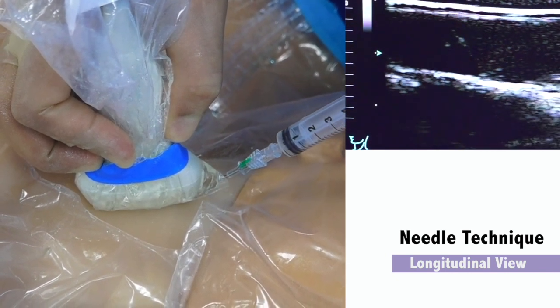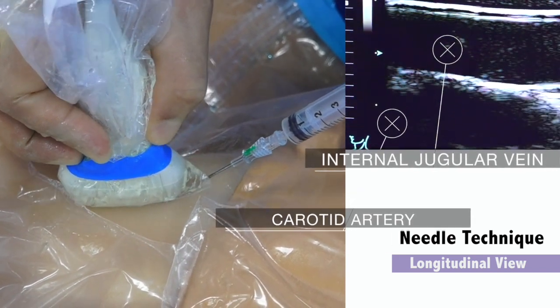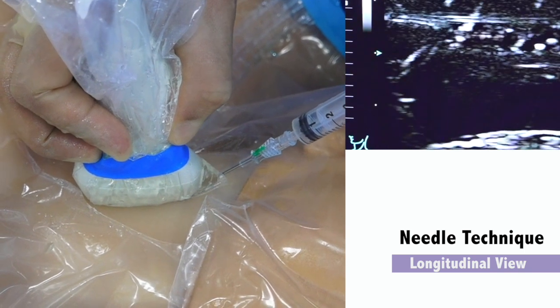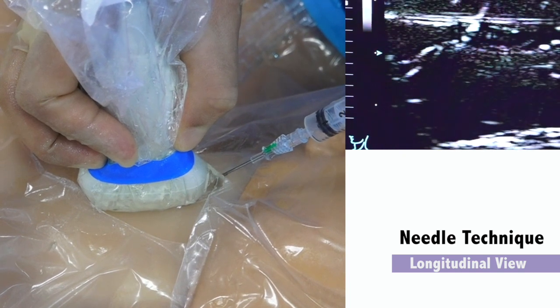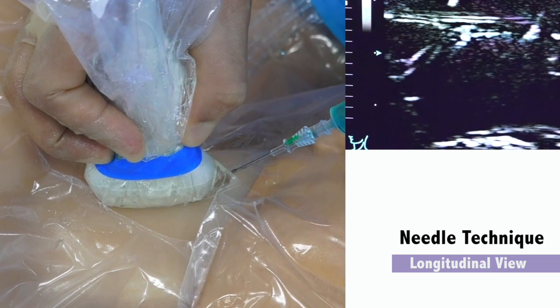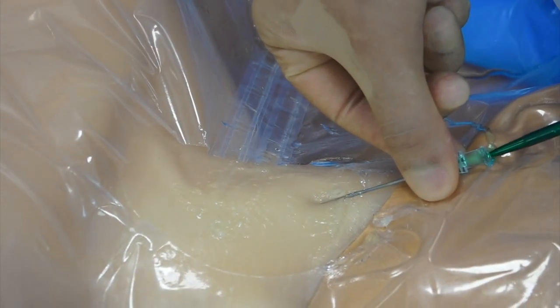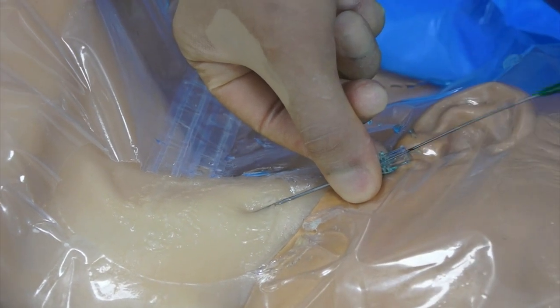This technique is the needle technique using a longitudinal ultrasound view. This is the same as the initial needle technique, except the ultrasound probe is positioned in plane with the needle and the internal jugular vein. With good alignment of the ultrasound probe, the entire needle should be visualized. The internal jugular vein is similarly encountered as a loss of resistance with the syringe filling with venous blood. Threading the guide wire is the same as in the transverse view needle technique.